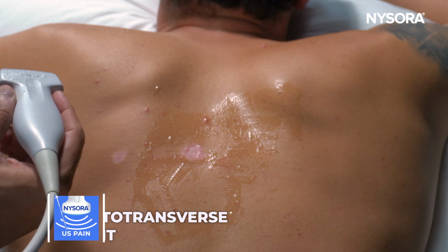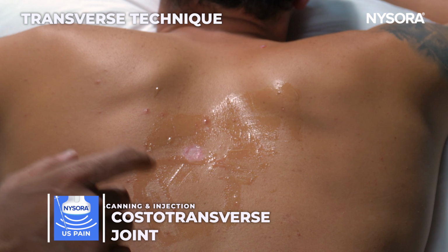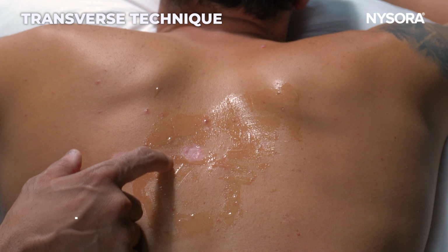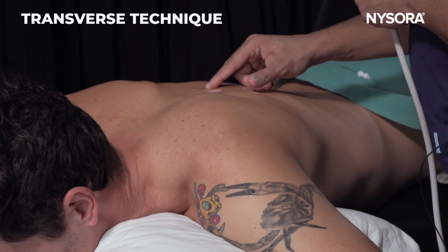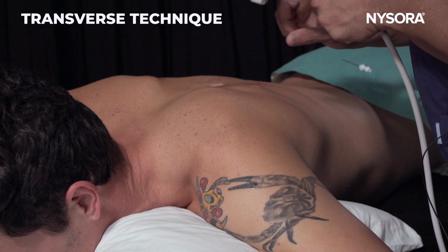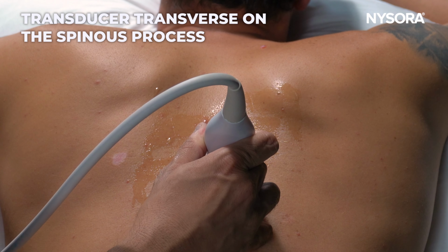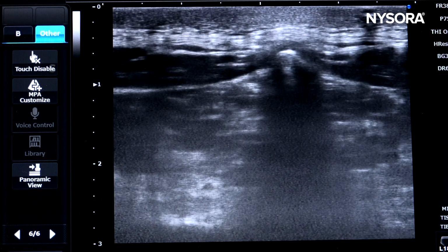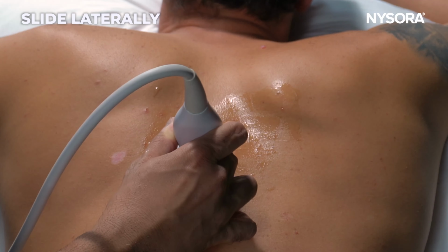I'm going to talk to you about the costotransverse joint injection. This could be one of the sources for posterior thoracic paraspinal pain. To do this injection, you will start with feeling for the spinous process, and you will put your probe horizontally or transversely on the spinous process. As you can see in the image here, the spinous process is nicely seen. Then you will move laterally.